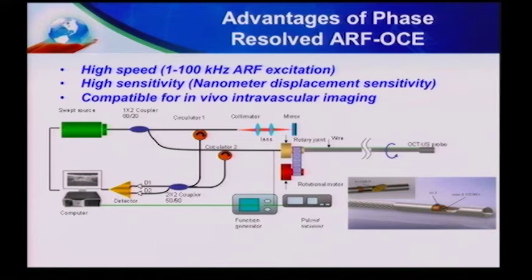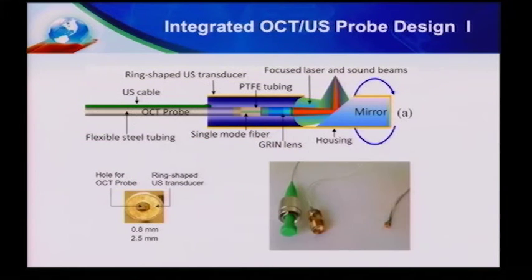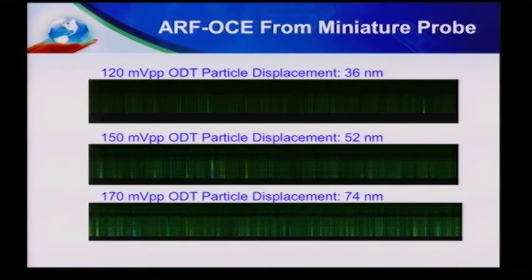So the next question is, can we do that in an intravascular probe? And one of the questions we have is, can you excite that, still have enough excitation force when you have a probe down to a millimeter size? We have not finished that study yet. We just constructed one of the probes with 2.5 millimeter, which is still too large, but as a first step to test that. And you can see that we can excite that tissue vibration with even a catheter-sized probe.